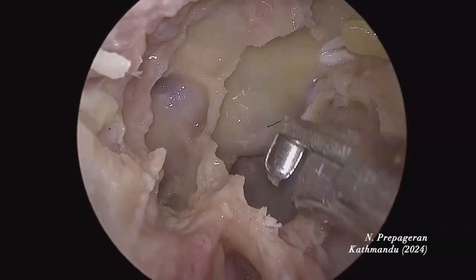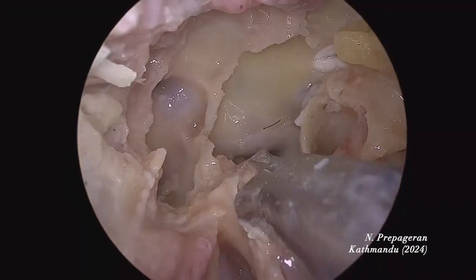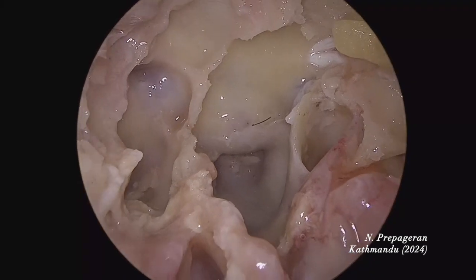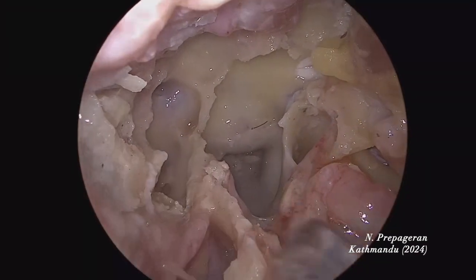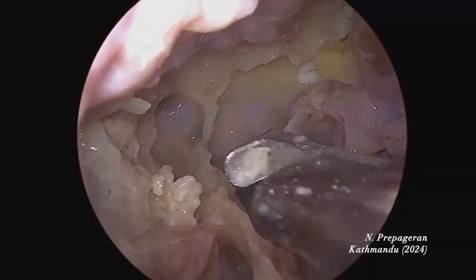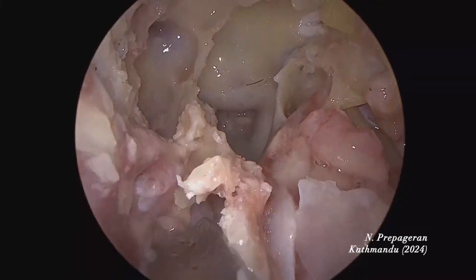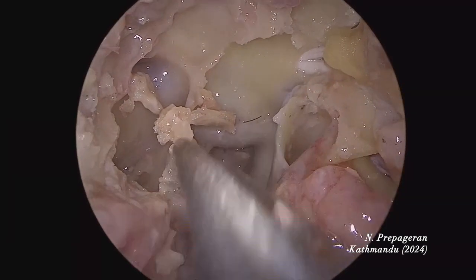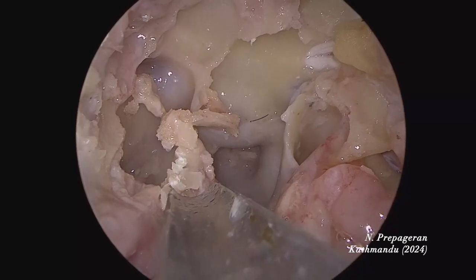Now I'm going to look at this abnormal anatomy. This is not normal. The best way would be to drill this — the only problem with drilling is you will destroy the view because you get bone dust everywhere. Let me remove as much as I can with a chisel. Can you see how effective a chisel is? A chisel is as effective as a drill if you place it properly.